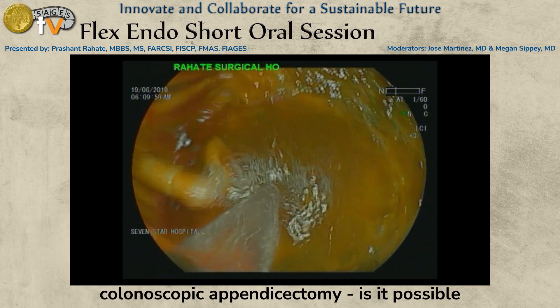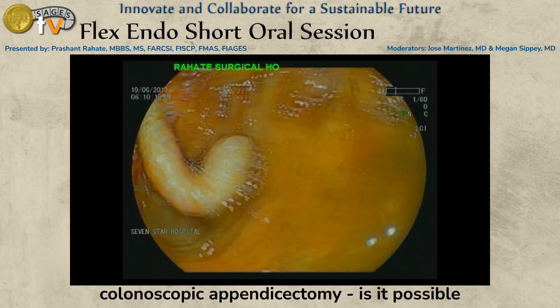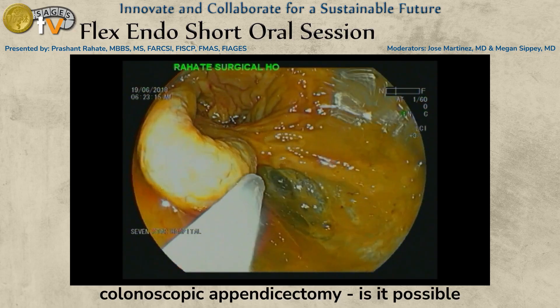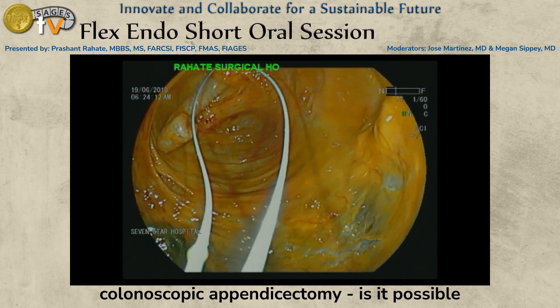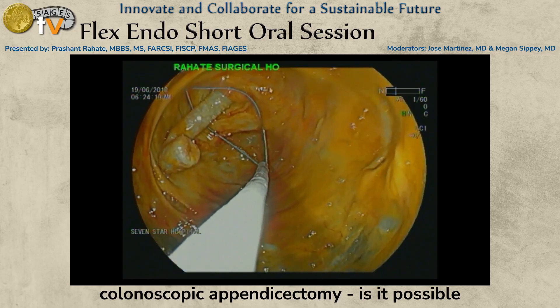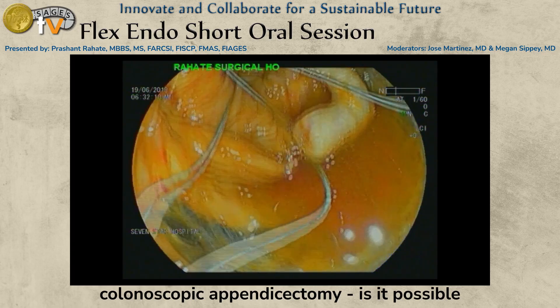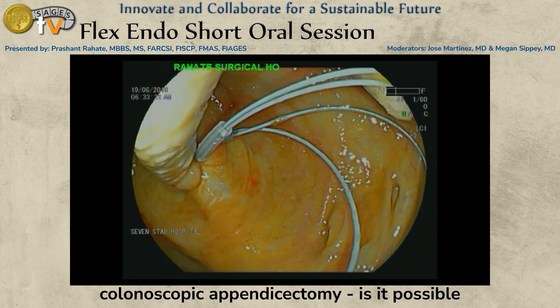We then give a complete wash. This particular patient also had right-sided diverticular disease. After washing, we view the base of the appendix properly, and this is one of the trickiest parts of the procedure. With a single-lumen scope, placing a loop and reaching up to the base of the appendix is really tricky, taking at least 10 to 15 minutes with multiple attempts. A double-channel endoscope would likely help considerably.